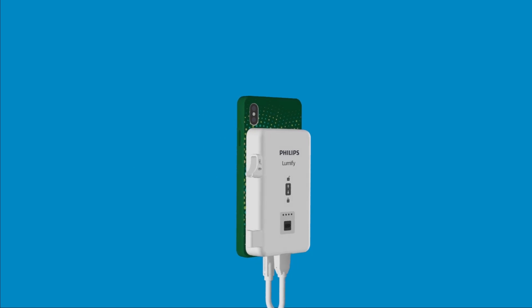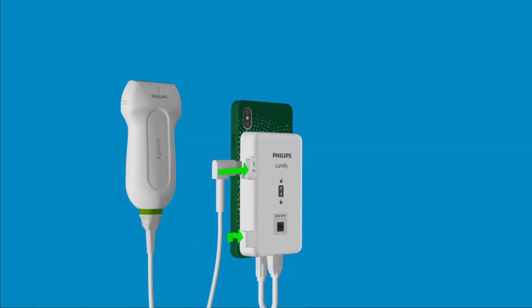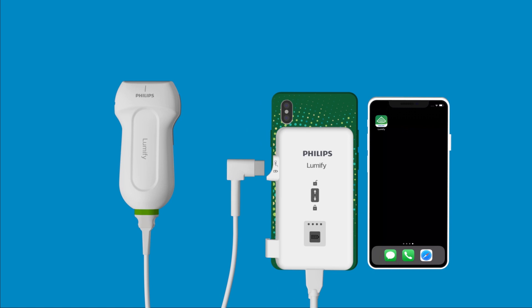Finally, connect your Lumify transducer to the USB-C port on the side of your Lumify power module. Notice the LEDs on your power module light up, indicating charge level.